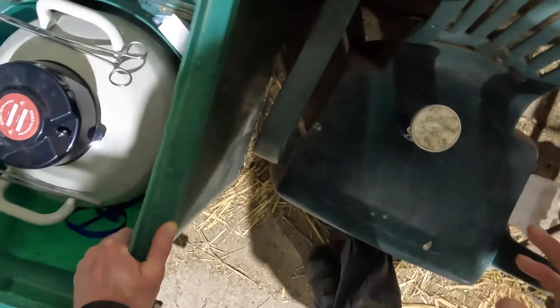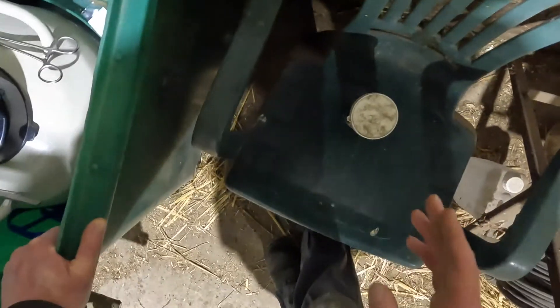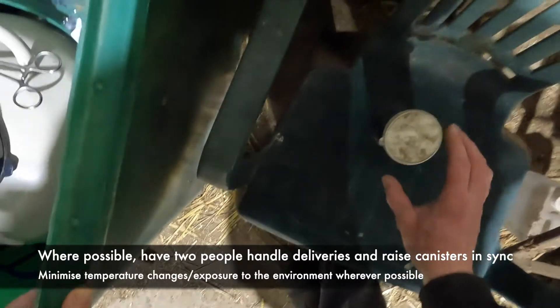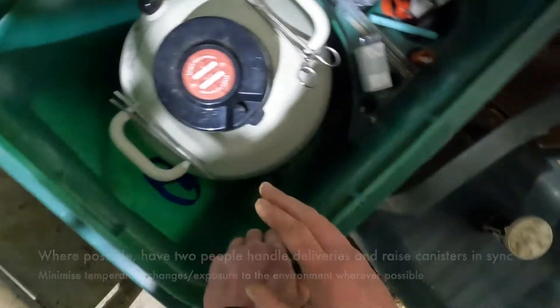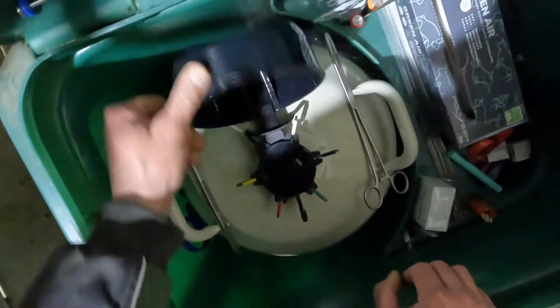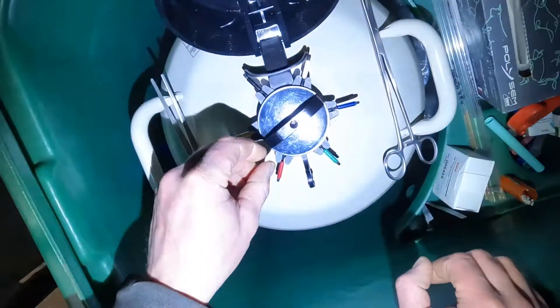I'll try and show you some ways around it and where I use the forceps. Because I typically deal with deliveries on my own and because you've got a bung or a lid to remove from your delivery shipper as well as your own flask, I'll show you how I do it and use forceps to try and save myself a bit of time. I'll just stick a head torch on so you can see what I'm doing.